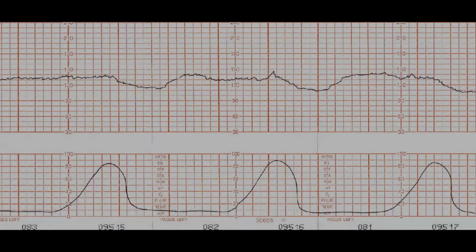It shows us there's placental insufficiency, which is kind of a big fancy way to say baby's not getting the oxygen supply that baby needs. Again, there are ways to fix this and it can easily be corrected, and other times the baby is just not having it and there's nothing that we can do from the outside via mom to help the baby. So we've had variables, earlies, accelerations is the A in the VEAL, and then the lates.